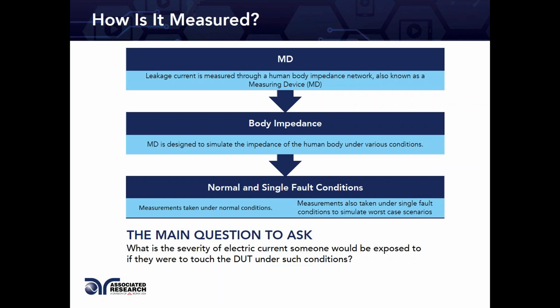Now, these are some of the cases where the standard is trying to simulate conditions that could be seen in the real world. And they're trying to mitigate the risk for electrical shock to either the patient or the operator. The main question that you want to ask is, what is the severity of electrical shock or electrical current someone would be exposed to if they were to touch the device under test, or your product that you're testing, under such conditions? So what would happen to one of your products?